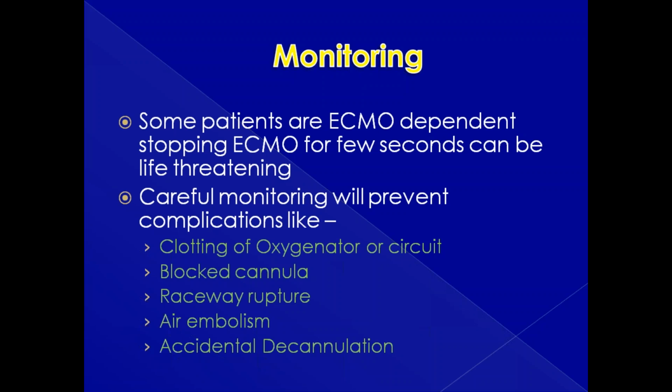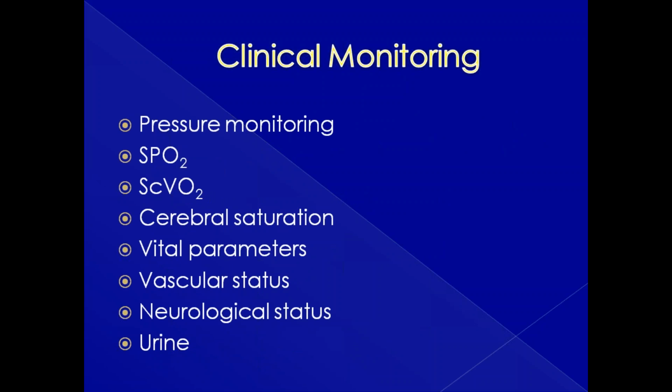These days, when you are encouraging the patients to move, and we're doing lots and lots of chest physiotherapy, cannulae tend to migrate if we are not putting a lot of emphasis on it. So when you are doing daily X-rays, be very, very careful that your cannulae are staying in the same position. If the cannula comes out, you will probably lose your patient. So you have to be extremely careful about accidental decannulation.